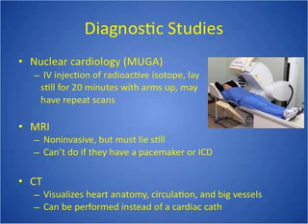They might have just a straight isotope they inject with a butterfly needle, or they might draw some of the patient's blood, mix it with the isotope, and then re-inject it. So then they watch the blood flow with this isotope in it, and they may repeat scans within a few minutes or even several hours after they inject. So make sure you understand that so that you don't get these tests mixed up.